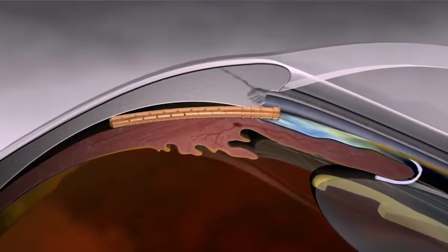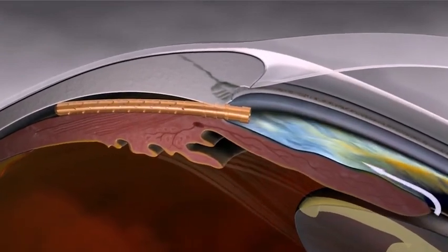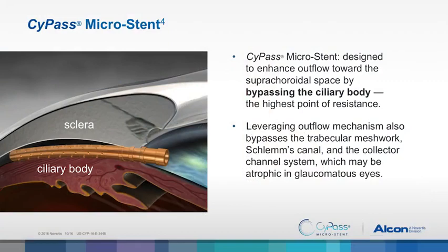Well, I think the uveoscleral outflow pathway has been a very prominent and potent IOP lowering mechanism, of course, with our drugs, and this is the first MIGS device that accesses the supraciliary space. The advantage, of course, in this space is the large resorptive area, which has potential for lowering of IOP at very low levels and very stable levels. I think this is an ability now to access that compartment with a more controlled procedure using a microstent. And by doing this, of course, we hope to control flow in a steady form into the suprachoroidal space to provide pressures that I think are lower for our patients and our targets.